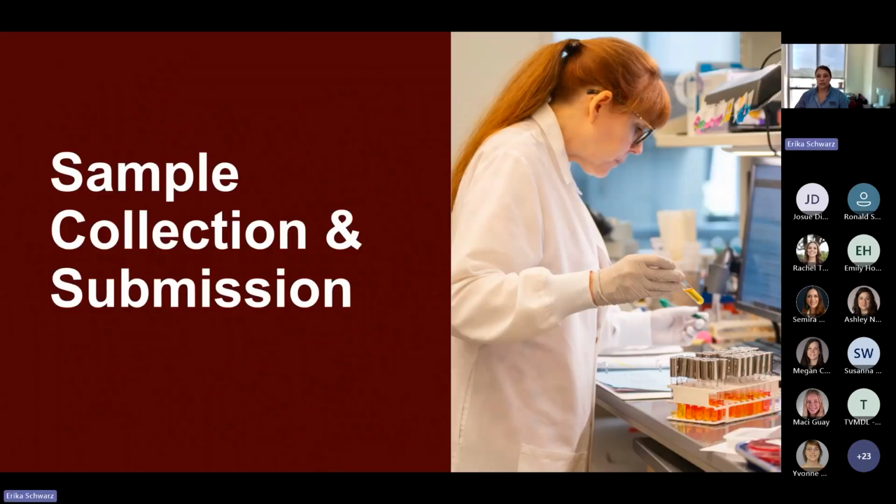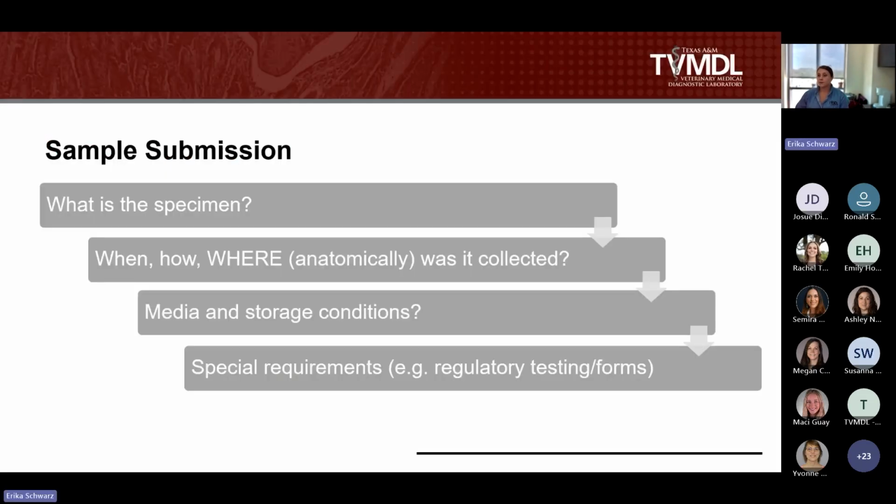So the first topic I'd like to discuss is sample collection and submission paperwork. After your physical exam, when you're formulating your differential list and you're deciding on diagnostics and you want to proceed with a culture, things that I generally try to encourage our clients to think about prior to submission include what we're collecting, what's the specimen that we're planning to take? Is that specimen going to be representative of the case and of what you're trying to learn? Are we sampling the right site? Are we collecting at the right point during the disease process?